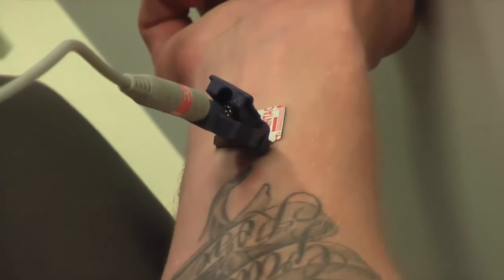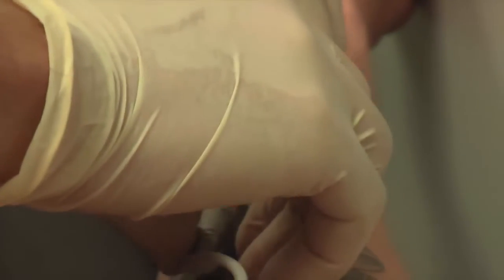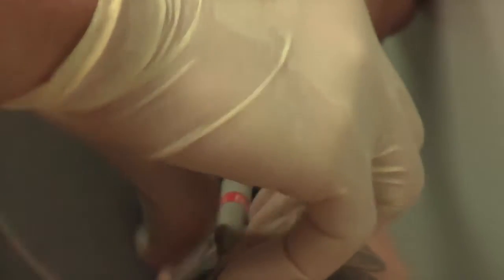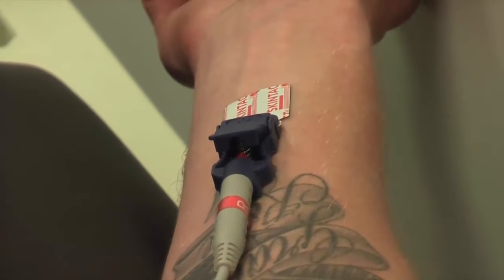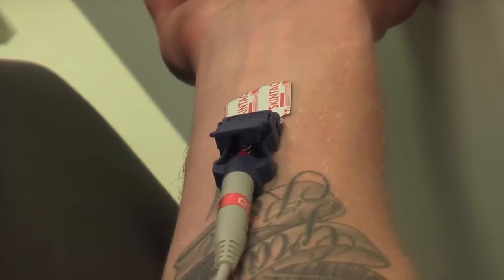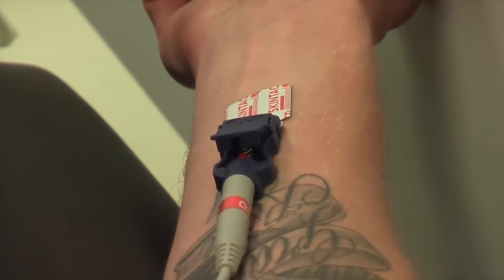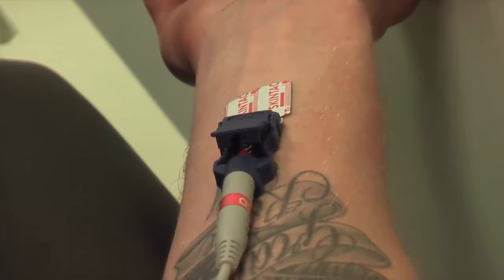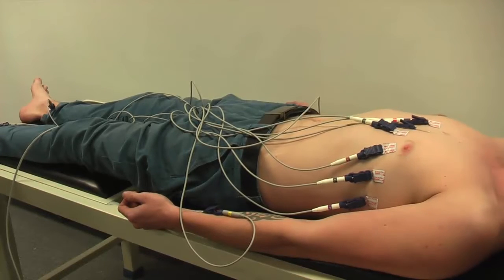If you have an electrode that's not sitting properly, loosen the cable and twist the banana plug so that the alligator clip is then able to sit flat against the skin. This will prevent the alligator clip from lifting the electrode from the skin and breaking contact.